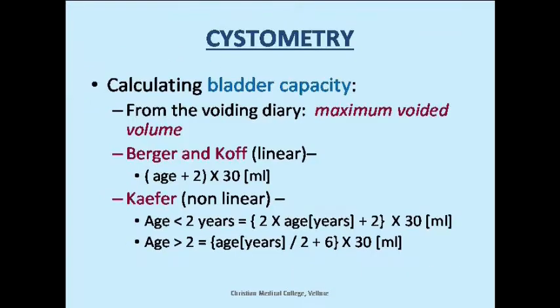And so basically you try to go as low as possible, basically 10% of the total bladder volume at that particular age. Formulas are well known to you, and make sure that you fill them slowly.